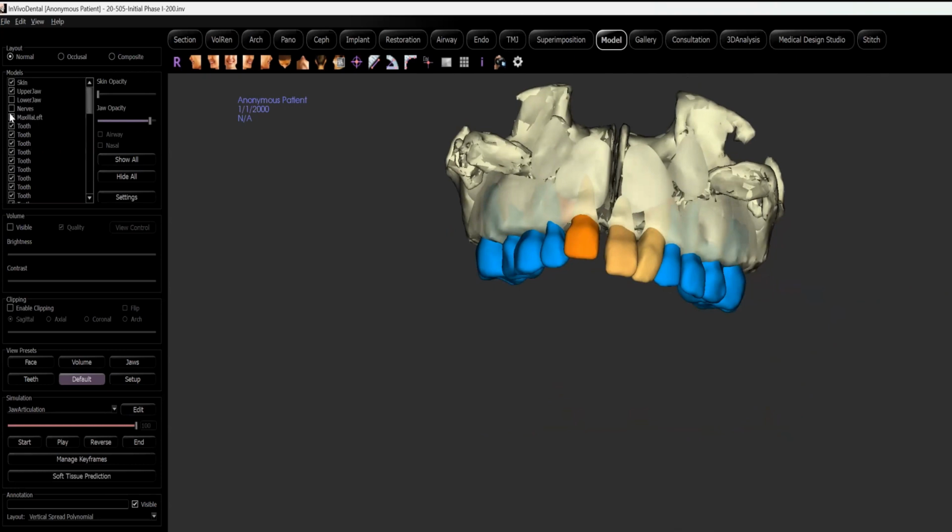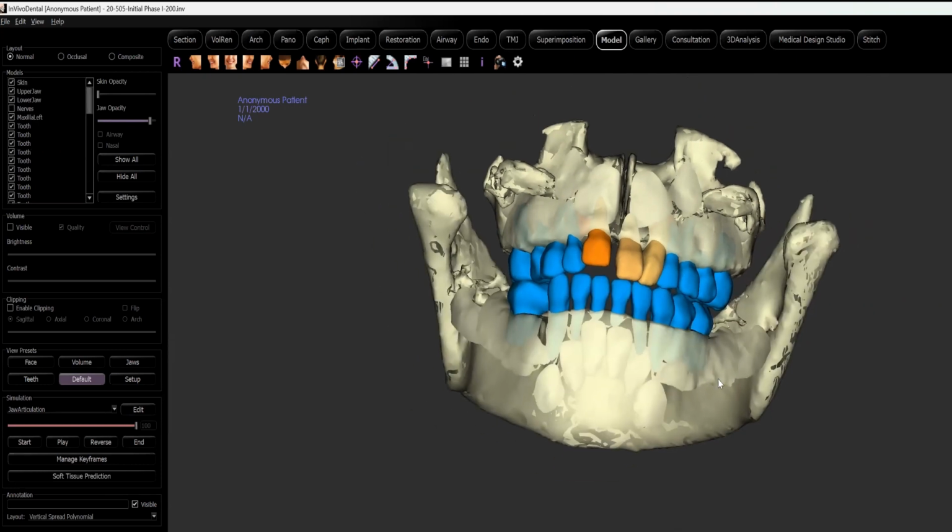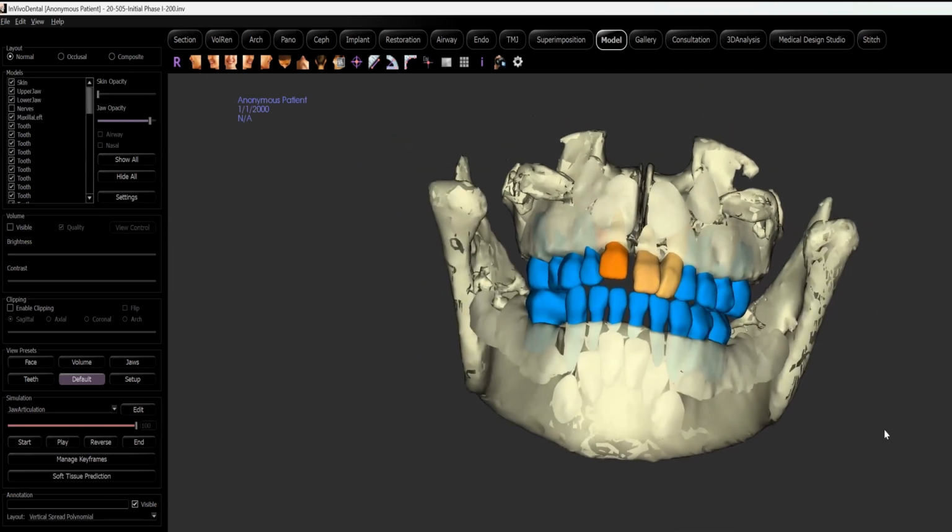Okay. And speaking of periodontal housing, right? There's, of course, a lot of systems now that will do digital models, and they have orthodontic capabilities to move teeth, like many of the aligner companies, which have come a long way. But in those digital formats, teeth know no boundaries.